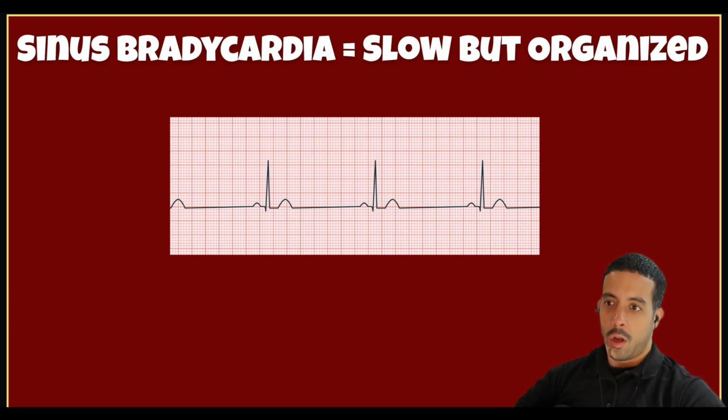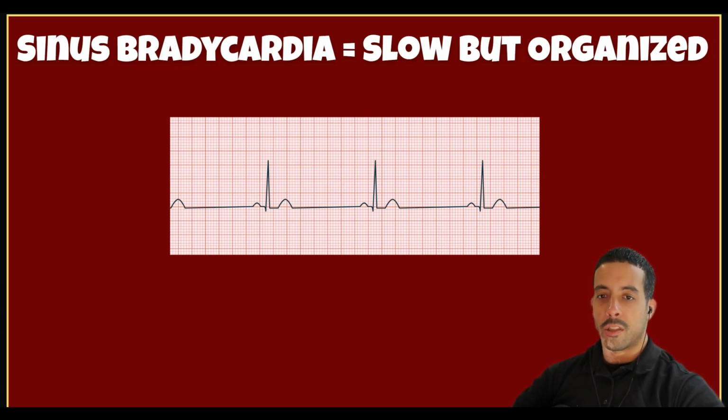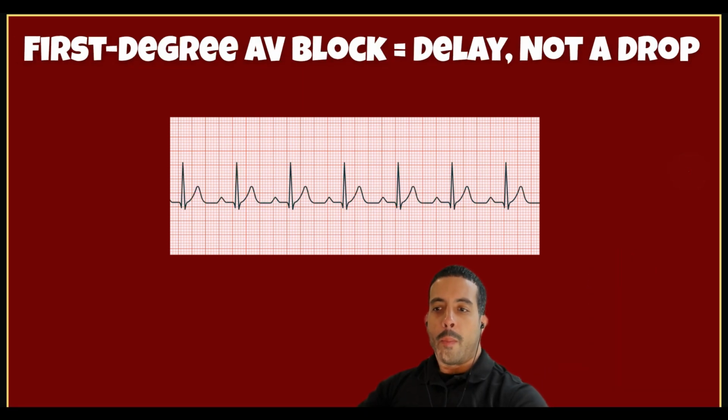But in a nutshell, the majority of sinus bradycardia patients that I've seen have never been treated by me. You just give them comfort treatment and take them to the hospital, because in the majority of cases, like I mentioned, this is not something that requires immediate intervention. Now, on to the next slow rhythm.